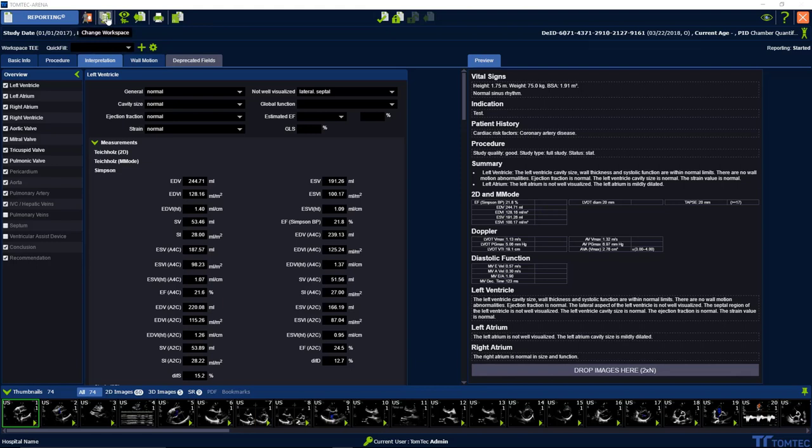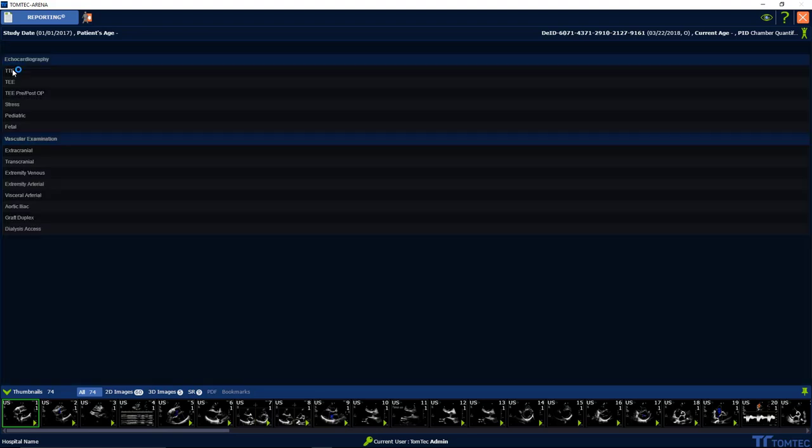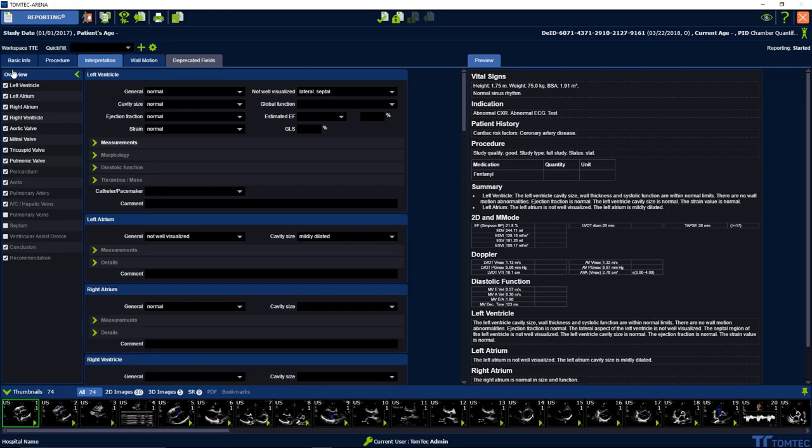The next icon to the right is change the workspace. That means if you have started your report with TEE for example, then during your work you can change the workspace to TTE for example. Your drop downs and your inserts on the right side will stay.